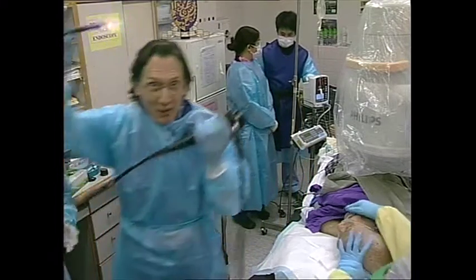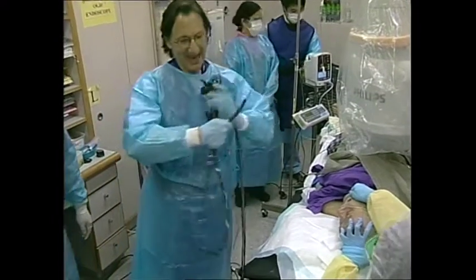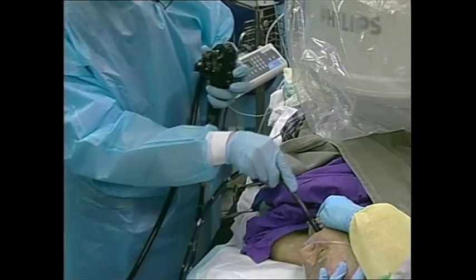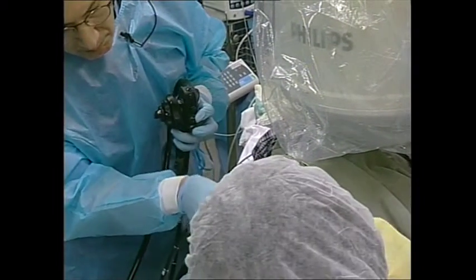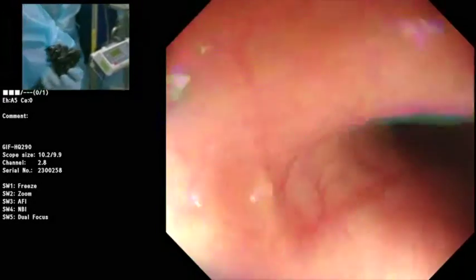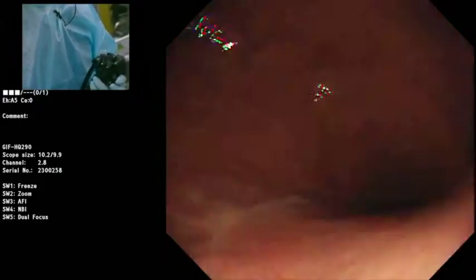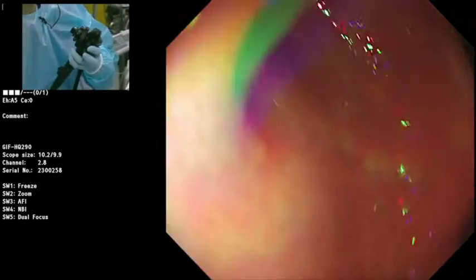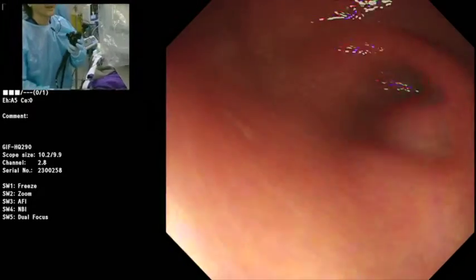All right, now we're ready with our gastroscope. And we'll insert and take a look. So this is a jet scope, so you can do irrigation as well. There you go. So that's fantastic that there's the jet irrigation. That means there's an accessory water jet channel. And that's always very helpful. All of our diagnostic scopes now have that.